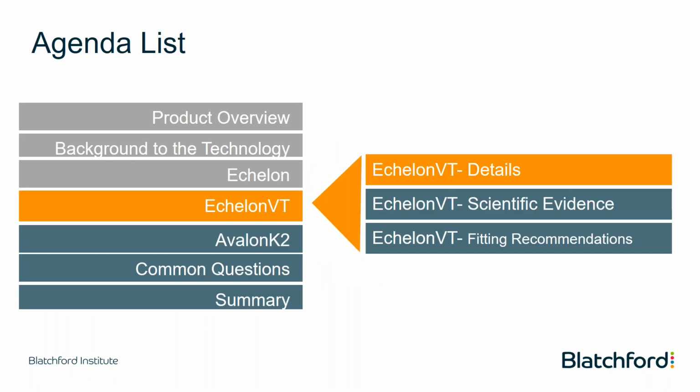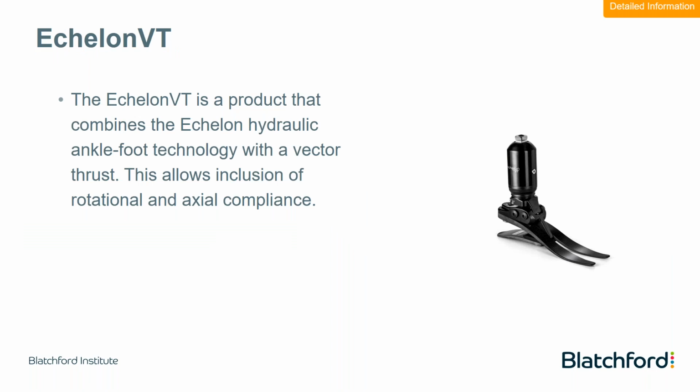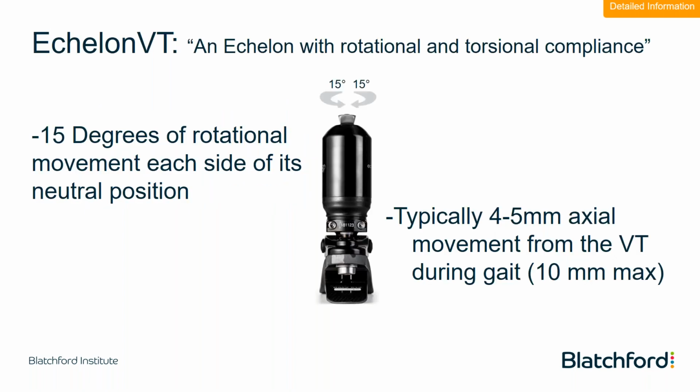The next foot in the hydraulic line we'll discuss is the EchelonVT. This is the foot that Lee is currently wearing. The EchelonVT combines the well-known Echelon hydraulic ankle foot technology with a vector thrust. The vector thrust unit allows the added benefits of rotational and axial compliance to the user. The foot is great for patients who want to participate in outdoor activities such as hiking or golfing, and also for patients who have a history of residual limb pain in their sockets, as we discussed in Lee's case. The EchelonVT gives you plus or minus 15 degrees of rotation on each side of neutral, allowing for a total of 30 degrees for the amputee.